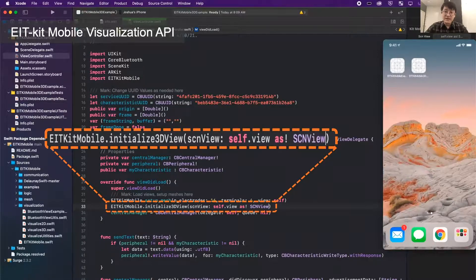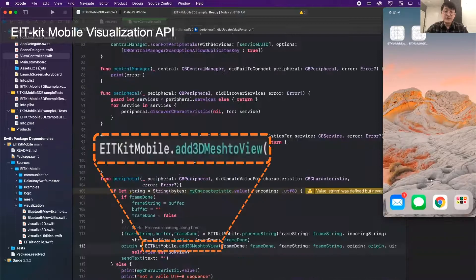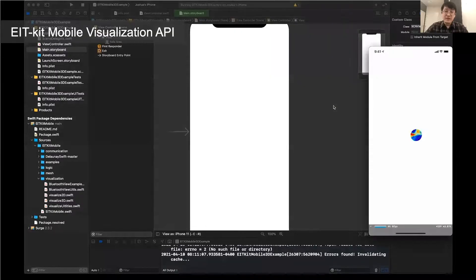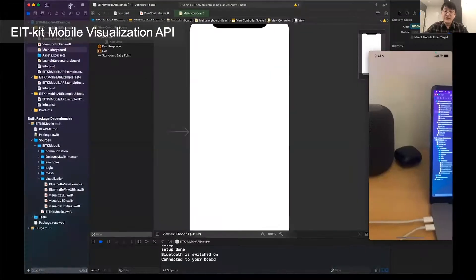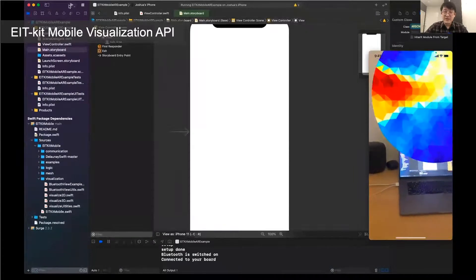Apart from the 2D visualization, the EIT Kit mobile visualization API also supports 3D view and AR view. For the 3D view, simply add the initialized 3D view inside the viewDidLoad function, and instead of add_mesh_to_view, call add_3D_mesh_to_view_3D to apply the solved conductivity onto a 3D mesh. Build and upload to the mobile device to see the EIT data visualized in 3D. For EIT AR visualization, users change the app scene view to the AR view, rebuild the application, and see the EIT data visualized in an AR environment.